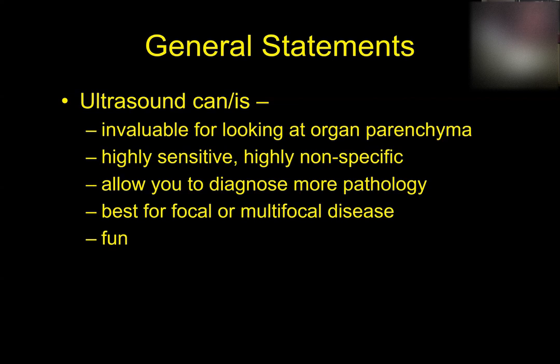We kind of hedge when we dictate reports because we have to say what we know is really true. And so we could say sonographically the liver or the spleen looks normal, but by putting the word sonographically in front of normal, that doesn't back us into a corner, because we know full well that there still could be disease in there. It doesn't show up all the time on ultrasound.